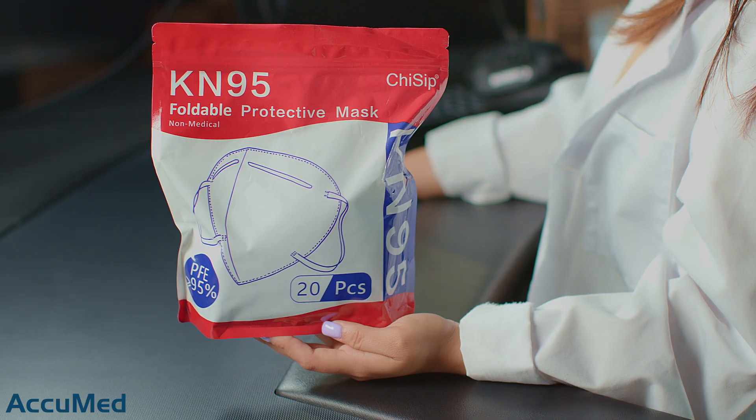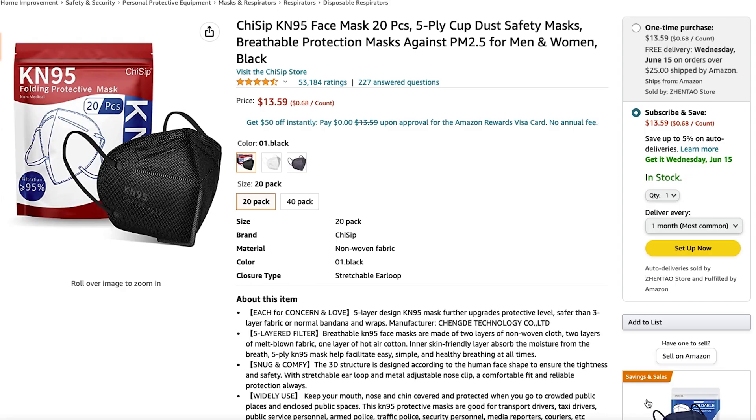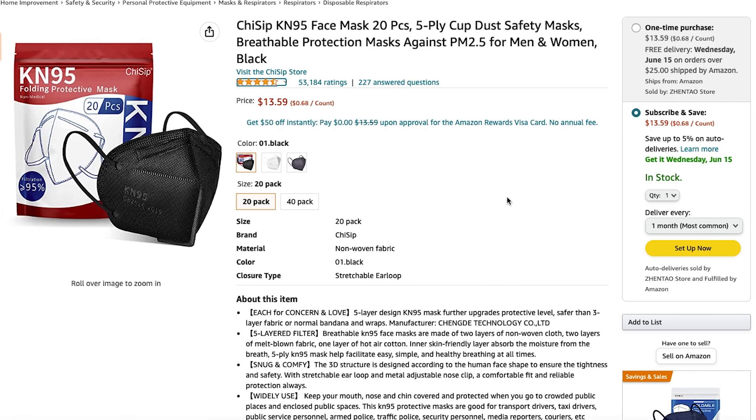Hello everyone and welcome back to the AccuMed channel. Today we're going to be reviewing the Chisip KN95 face mask. This is the Amazon listing — they come in a 20 pack for $13.59 and have a 4.5 out of 5 rating with over 53,000 reviews. That's a lot of reviews. Let's go ahead and take a look at these masks and see how they look. They come in a 20 pack, so there are 10 in each little bag.